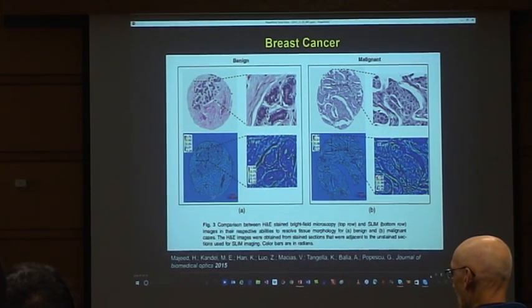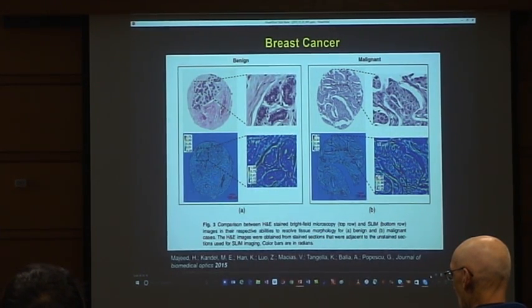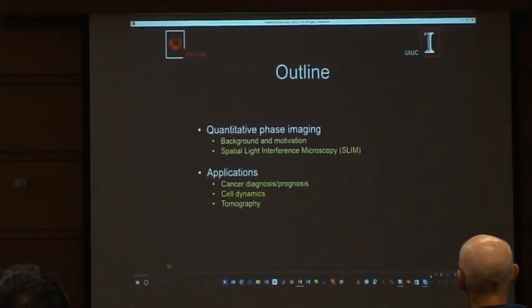And they weren't as good as with H&E, but not much worse. So there were a few percentage points below the H&E with 10 minutes of training. On H&E, they got 6 years of training. So basically, that proves that the structural information is there for diagnosis, therefore we can move forward and do what we did in process.